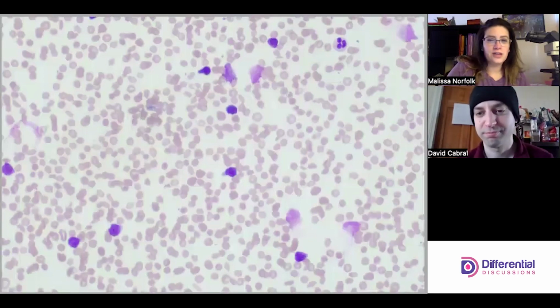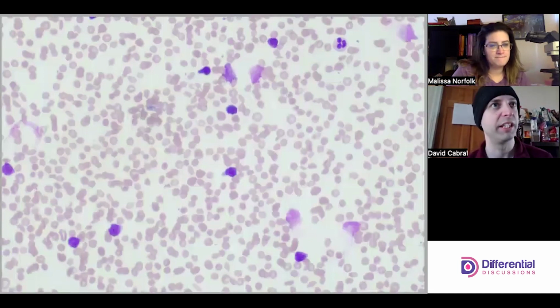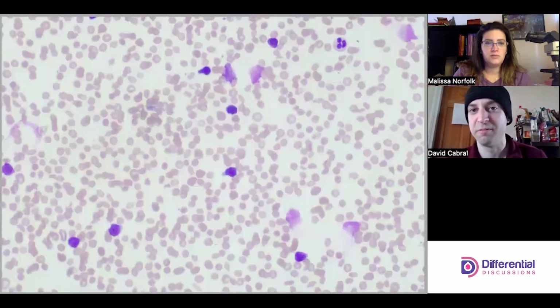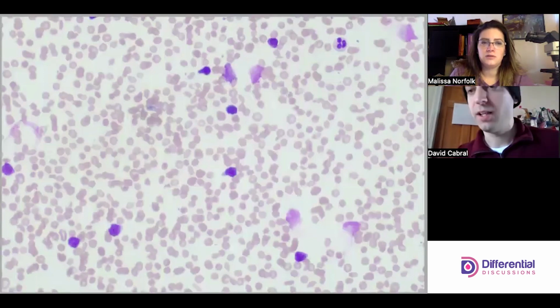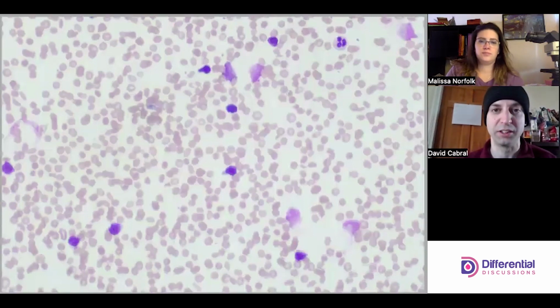Today we're going to look at a different presentation of ALL. We looked at an ALL previously, and they had, I love the word scanty, very scanty cytoplasm. So the NC ratio was through the roof, like 99 to 1 or something crazy. And the nucleus had that kind of smudgy look to it. The nucleus definitely shows some kind of abnormalities, but not blasty, not like the typical blasty pattern that we might see.